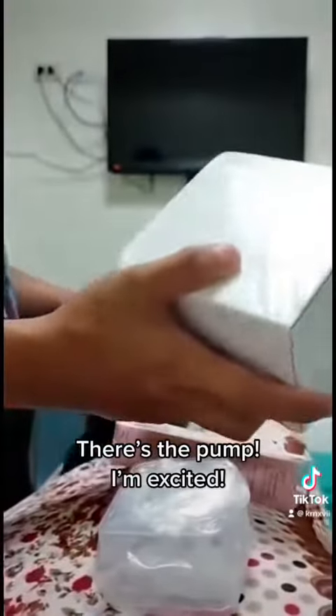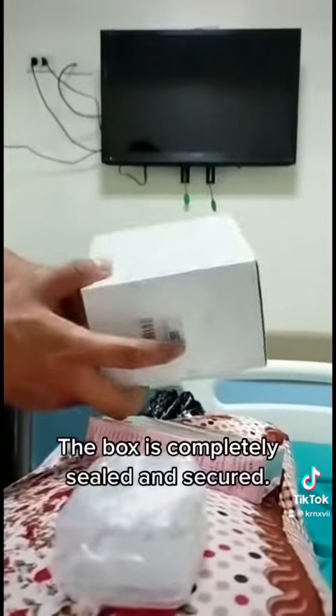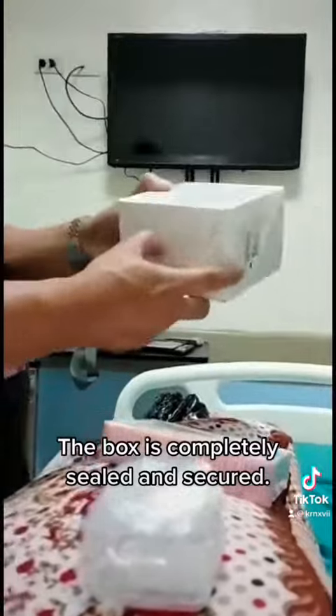There's the pump — I'm excited! The box is completely sealed and secured.